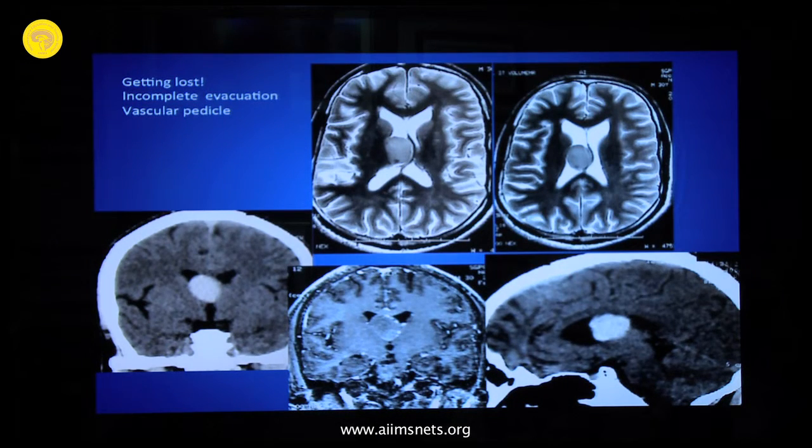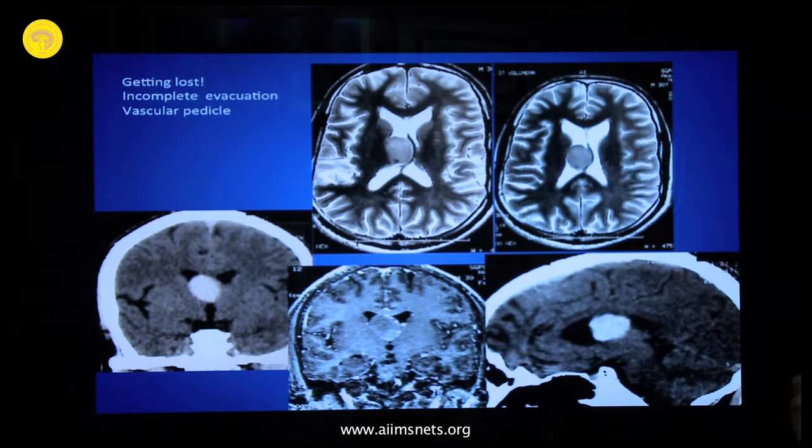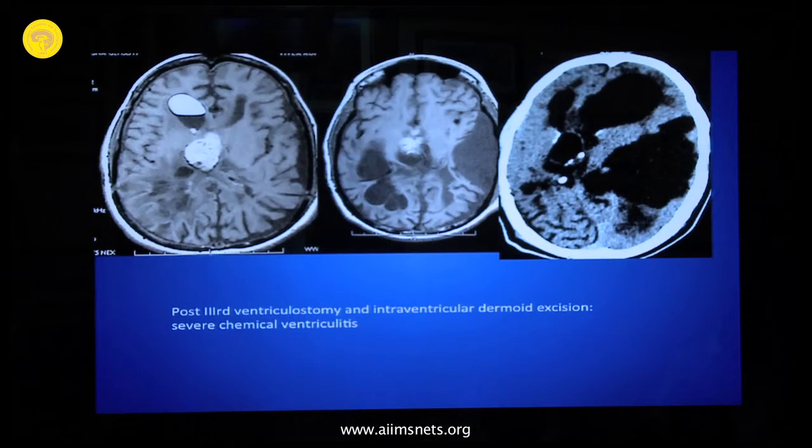The other thing is, when you're doing a colloid cyst, like the situation which came. This was a classical situation. You think this is also amenable to removal, but this is a little posterior. It appears classical, but sometimes it will not come at the foramen of Monro. Here, don't go in endoscopically. If you think that it is, don't go in endoscopically. This is another important thing.